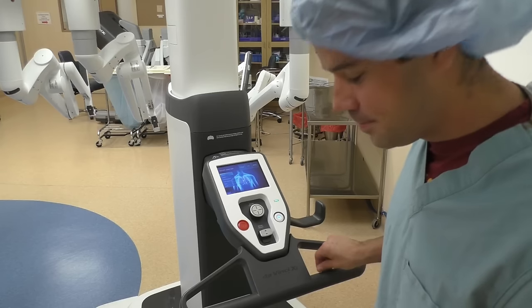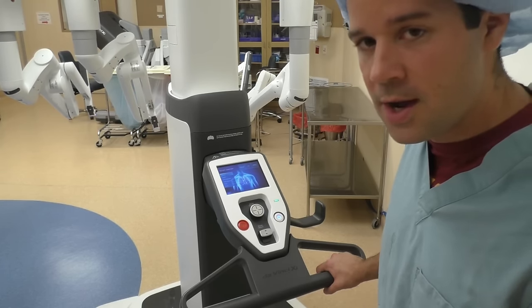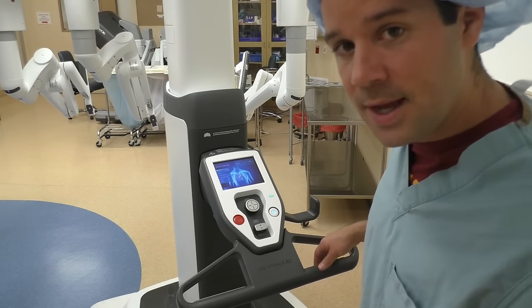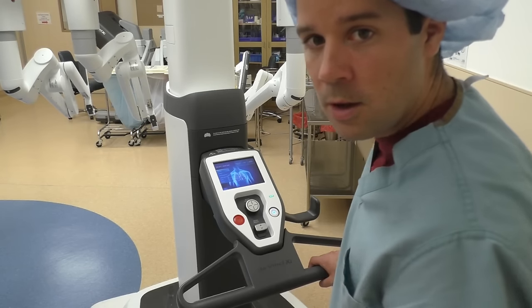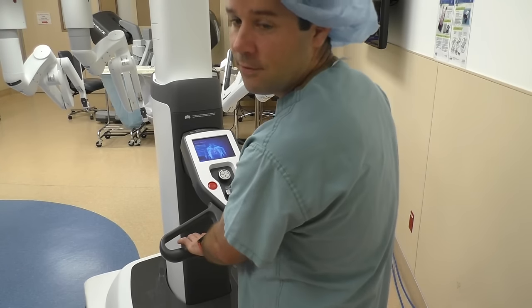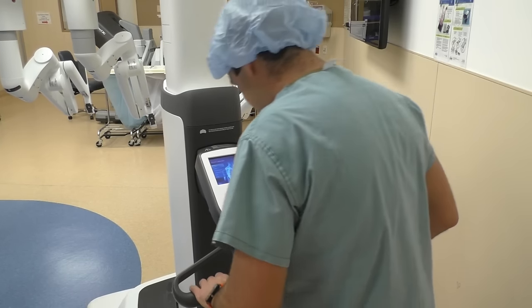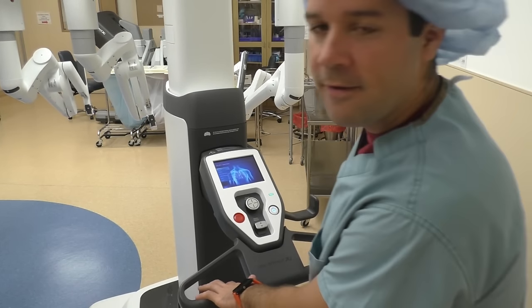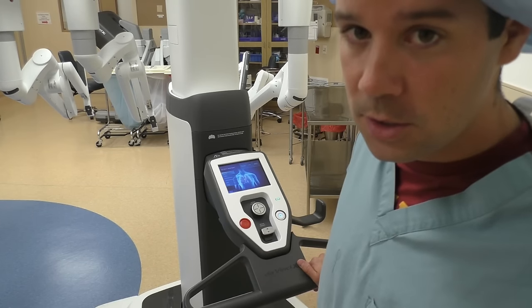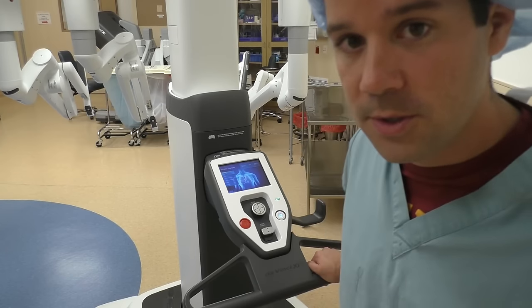We've gone over most of the specifics on the back of this robot except for these little handles here — this is how the nurse is going to drive the robot in so you can dock it with the patient. Underneath these handlebars are basically just two big long buttons; you push those in and it automatically drives for you. It's super easy — left and right, back and forth. It has a drive mechanism built in, so even though this robot is huge and heavy, the drive mechanism makes it very easy to move.